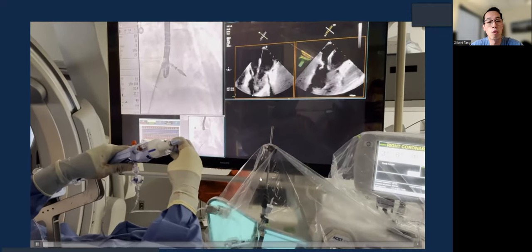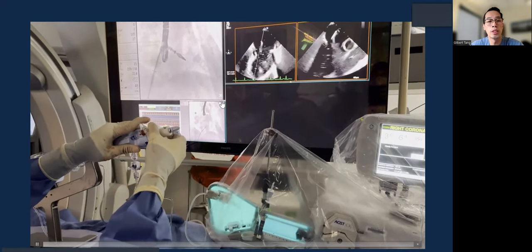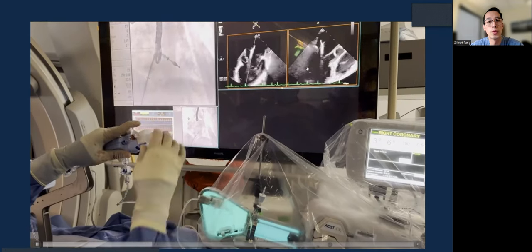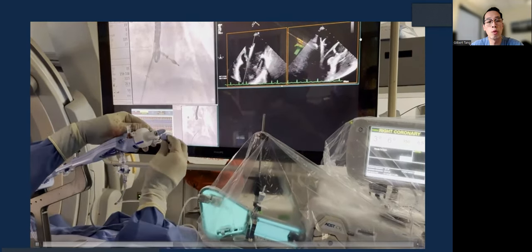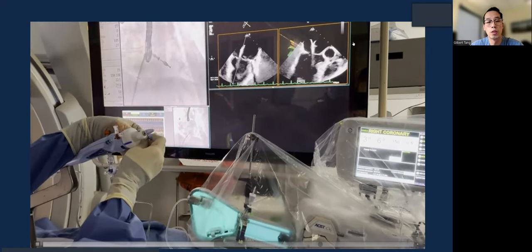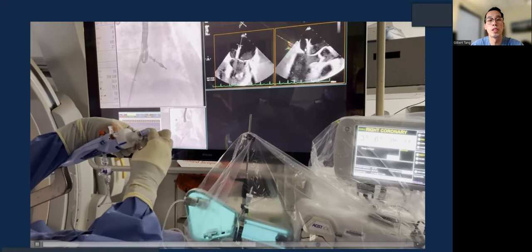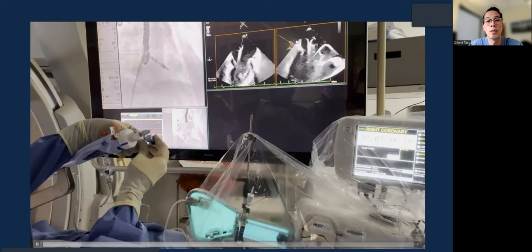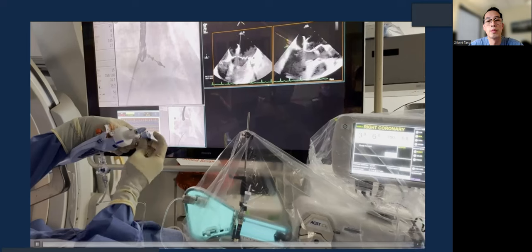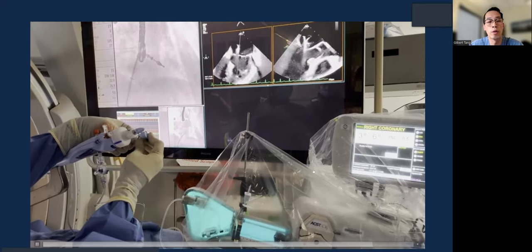Here's how it works: you raise the grippers, unlock the clip, and the clip is open. Then check each gripper — unlatch, drop it, and see the posterior gripper arm coming down. Then the anterior gripper comes down and up. You check that, then relatch and confirm your gripper orientation.